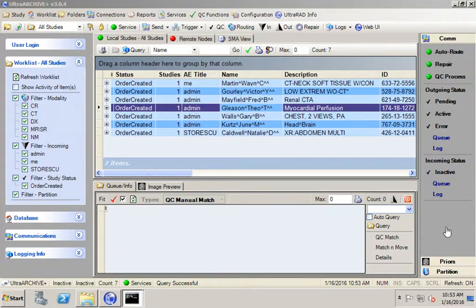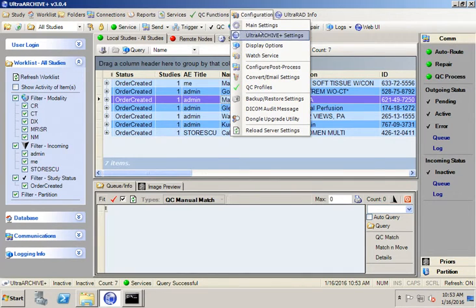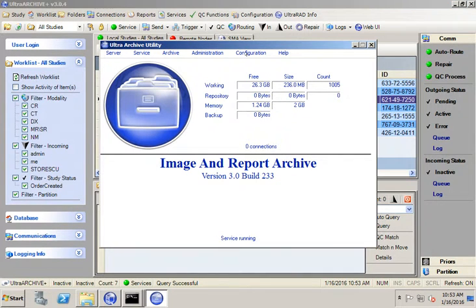In this video, I'm going to show you how to use the TCP logging features in UltraARCHIVE Plus, which gives you a tremendous amount of logging when you're working on issues with DICOM transfer with this product. First, I'm going to click on Configuration, Archive Plus Settings, and this logging that I'm showing you is only valid for sending and receiving on the archive ports.